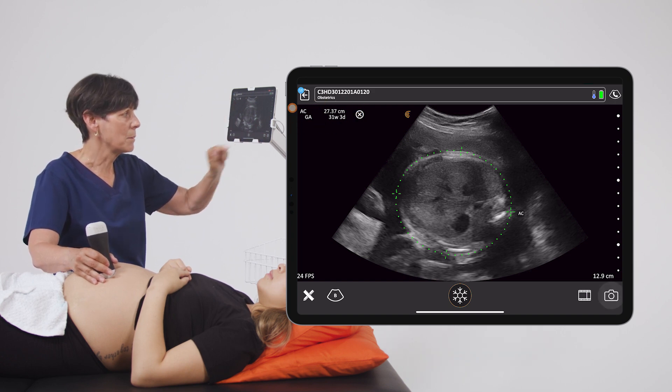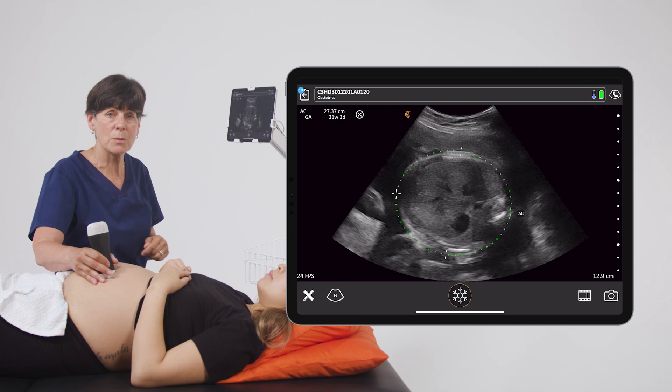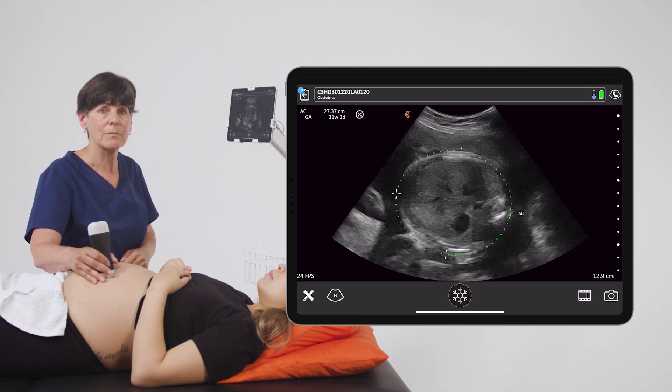We'll take an image. This stores the measurement into the report and you can proceed with the rest of the exam.